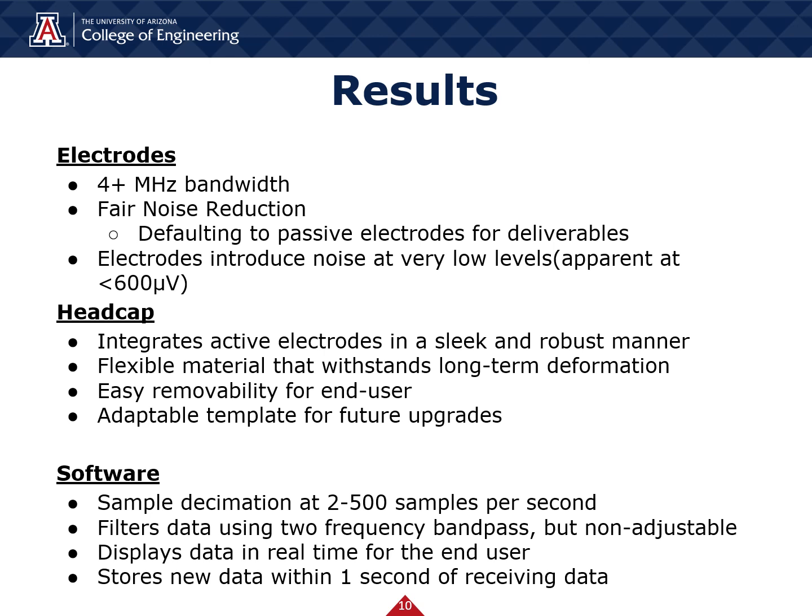The software component gives the visuals needed to graph the incoming data from an arbitrary source. Although C# is not as fast as C++ for digital signal processing purposes, C# provided an excellent program to achieve the visuals that were crucial to the program.